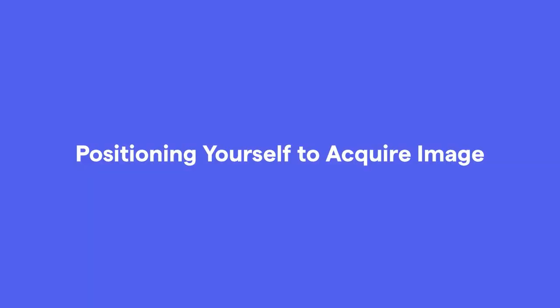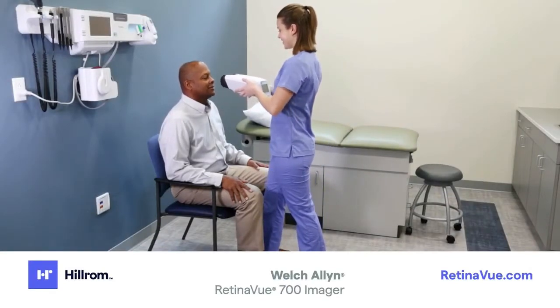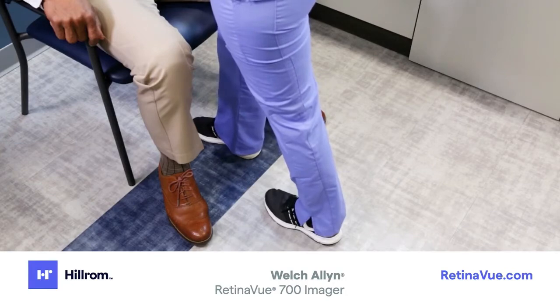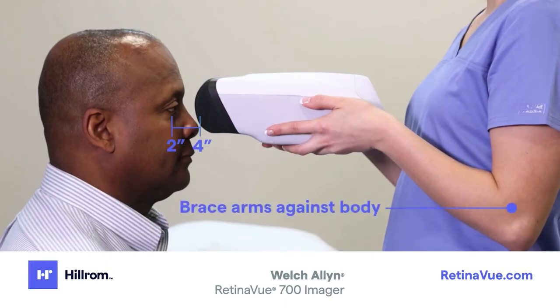Positioning yourself to acquire an image. Position yourself in front of the patient and hold the imager with the screen facing you. Be sure to grip the imager firmly in a position that allows your thumb to reach the touch screen. Place one foot in front of you close to the patient — this will allow you to move the imager toward the patient's face in a controlled and stable manner. Hold the imager two to four inches directly in front of the patient's eyes, and brace your arms against your body to help keep the imager steady.